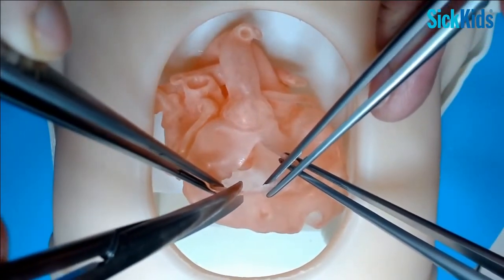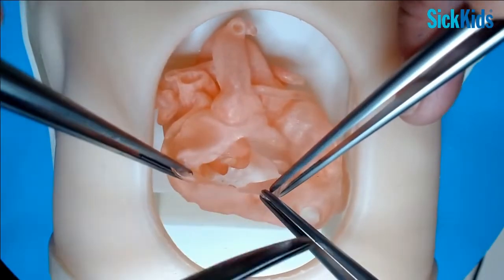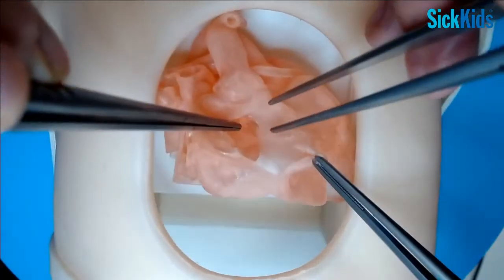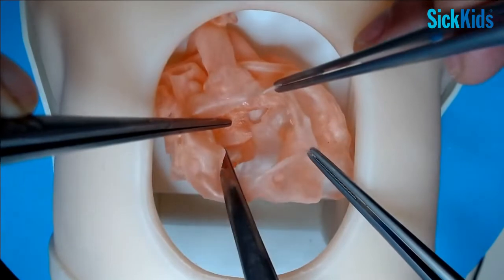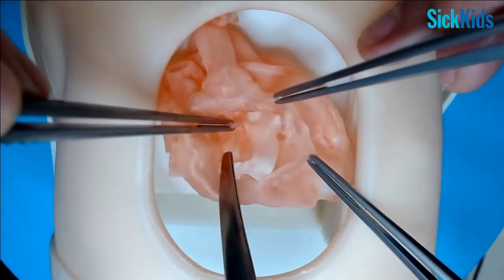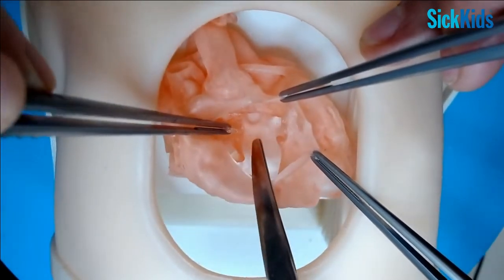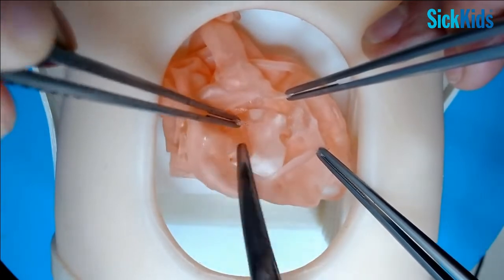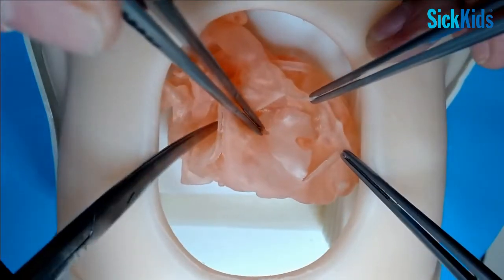Let's just make it a little bit bigger today so we can see easily - this is a stiff model. You often need to just take a few minutes with a Taussig-Bing, or with a difficult heart, to sort out where everything is.